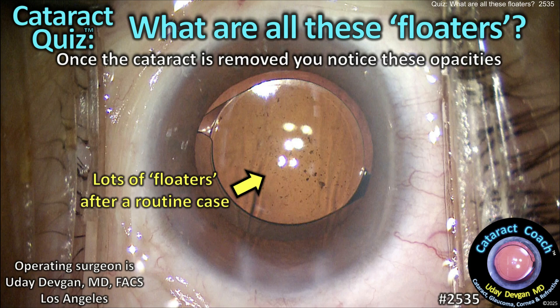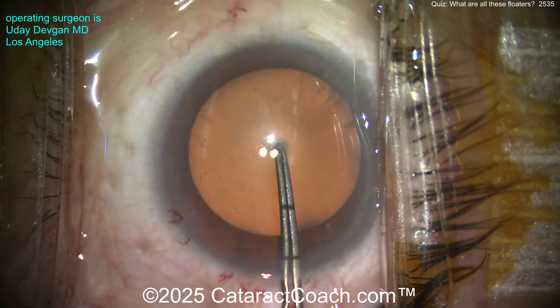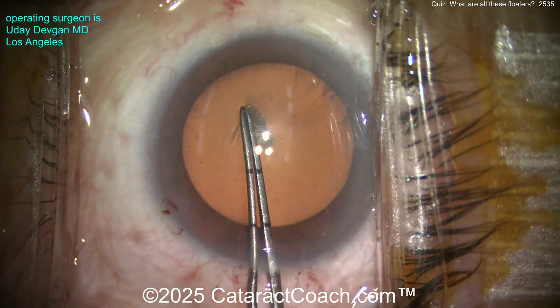From cataractcoach.com — cataract quiz: what are all these floaters? Once the cataract is removed, you notice all these opacities in the vitreous. Now watch carefully at the beginning of the case. Did you see the radial wrinkles there in the lens capsule? Look — it's wrinkling.